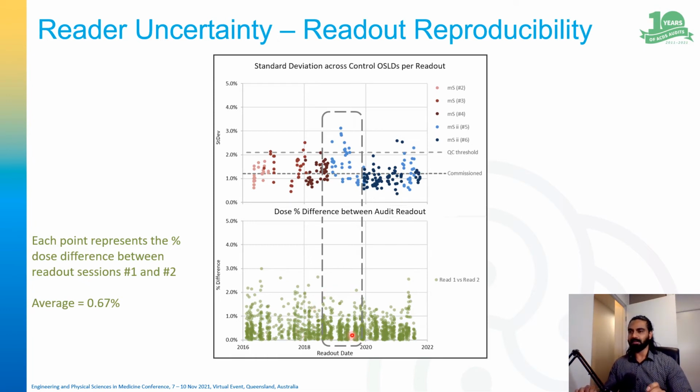What we suspect is that the OSLDs are extremely positionally dependent, and the micron level grinding away of the drawer was causing a physical change into positioning of the OSLD in the reader, which produced a signal which was different to the expectation value. So this created a period of high noise in the reader. This was reproducible though, as demonstrated by the percentage dose differences.